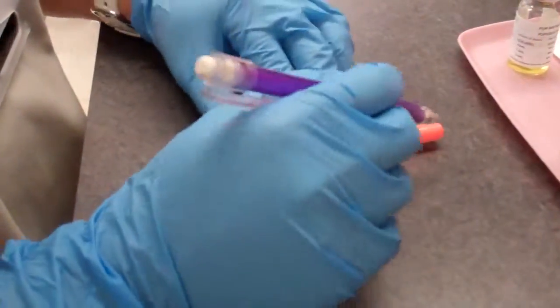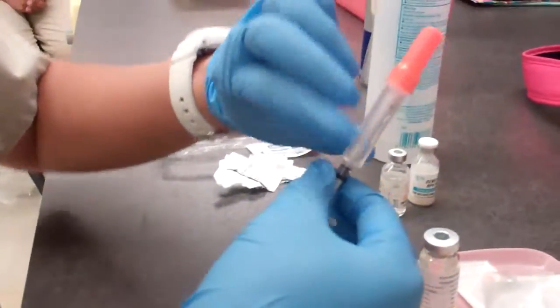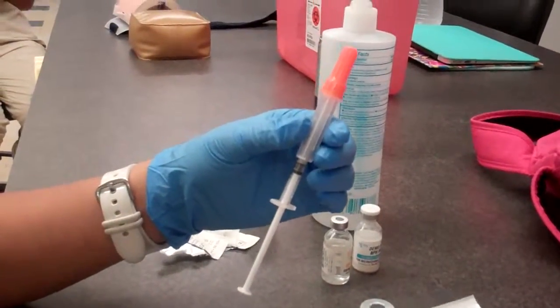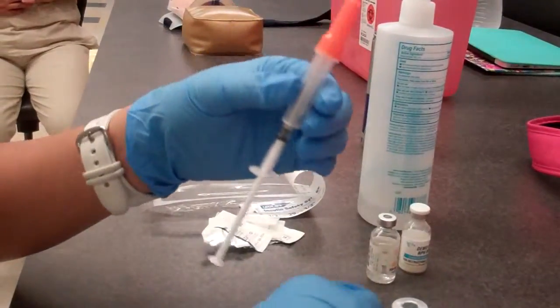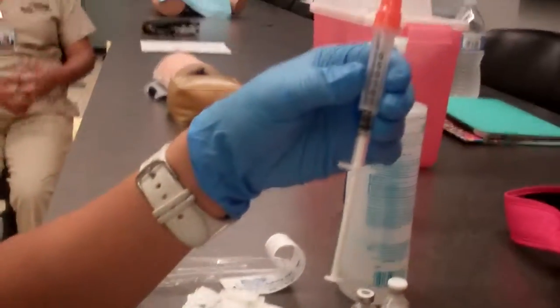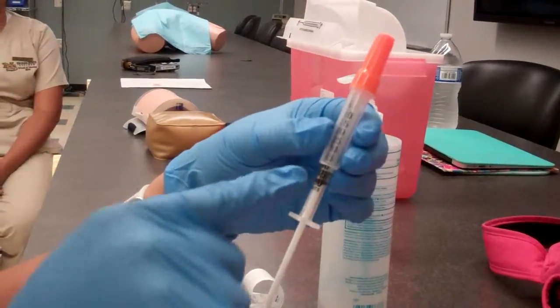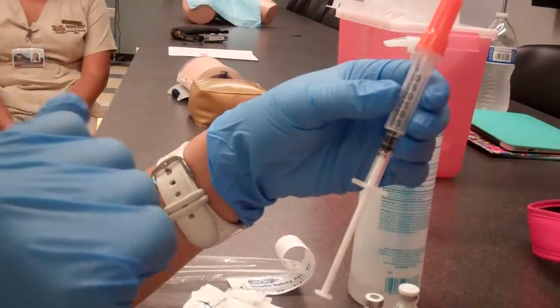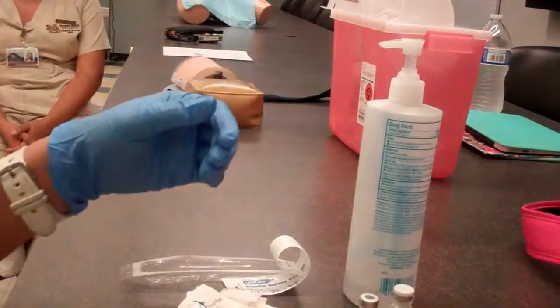I would label for my medication that this is a mixed insulin. I would also note my initials, the time, which is currently 5:53, and I also note that it is 43 units, and also note today's date, which is 10/12/2015, with my initials.